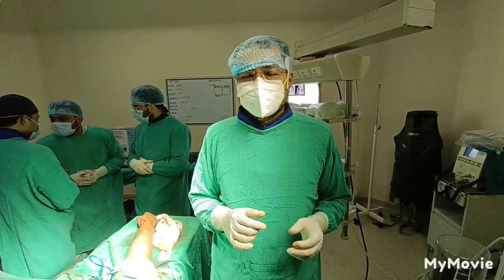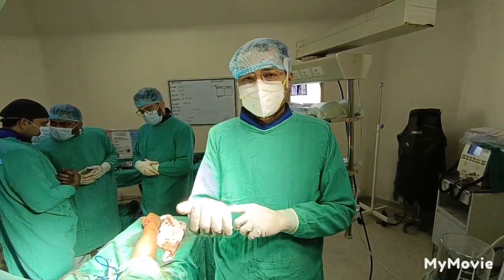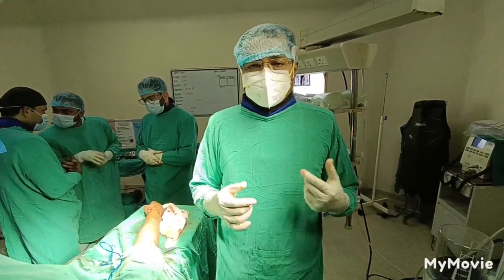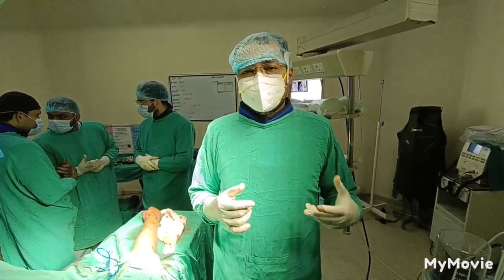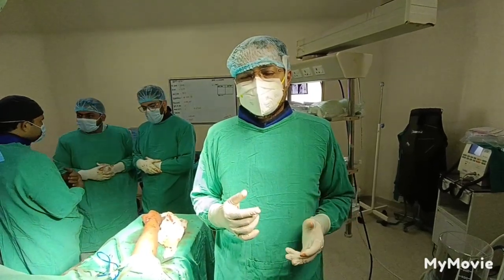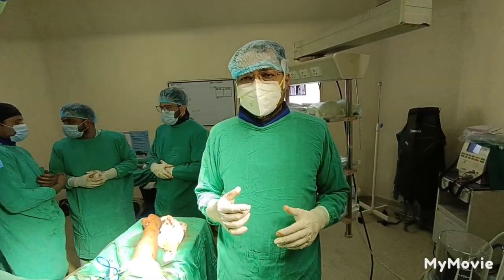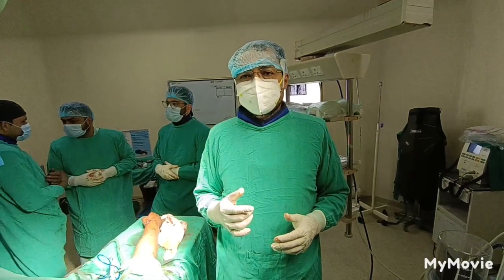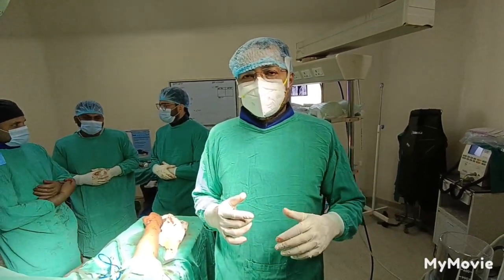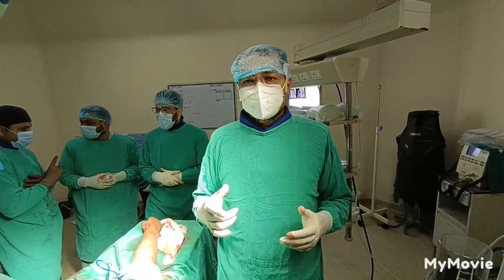There was swelling and a wound over the volar aspect of the forearm. It was initially managed elsewhere. The patient had arrived yesterday, and we kept the arm elevated. Today the patient was posted for surgery. First we tried closed reduction, but closed reduction was not coming.